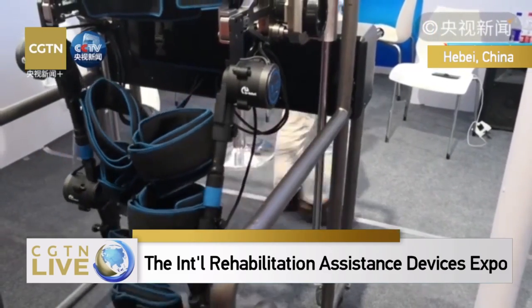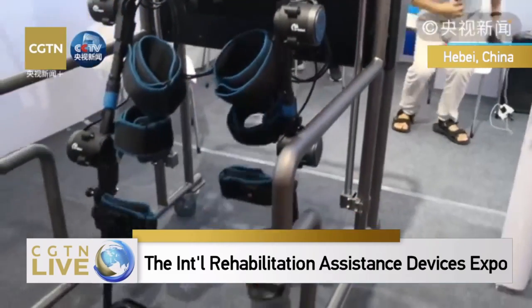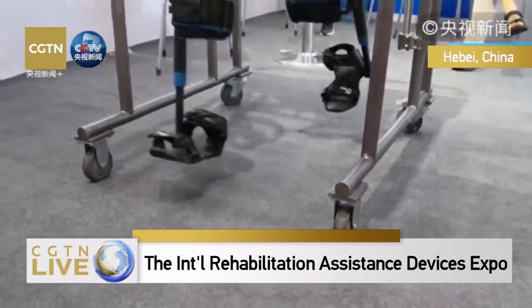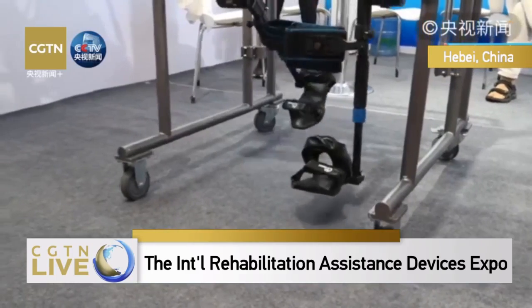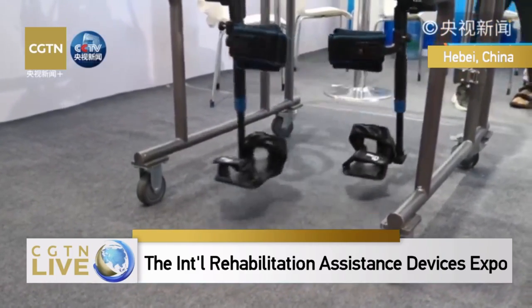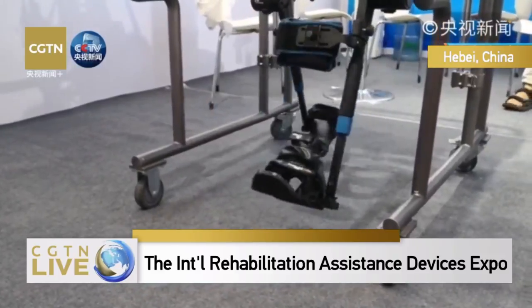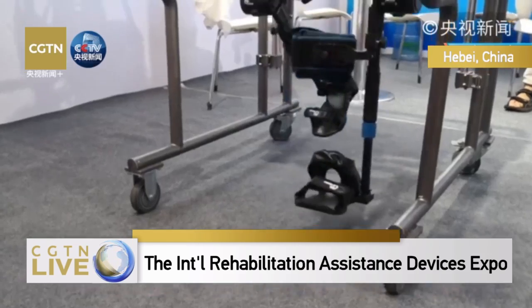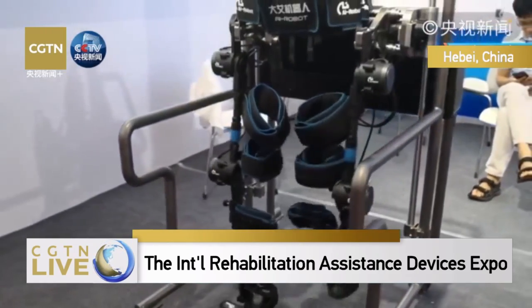These are like wearable devices. For some patients, they cannot maintain upright in their upper body. So it's a full body exoskeleton helping to support the weight of someone.